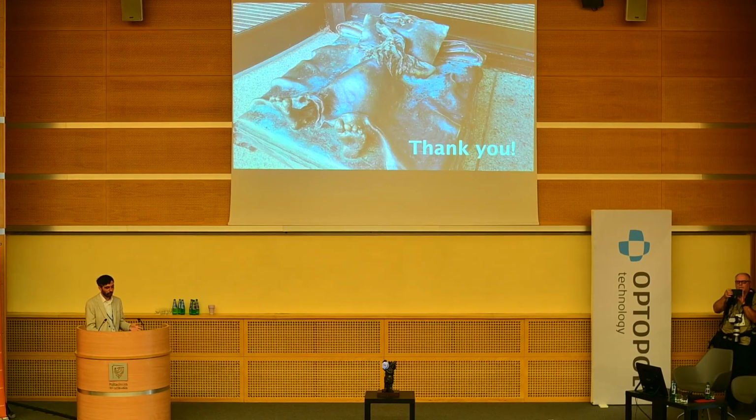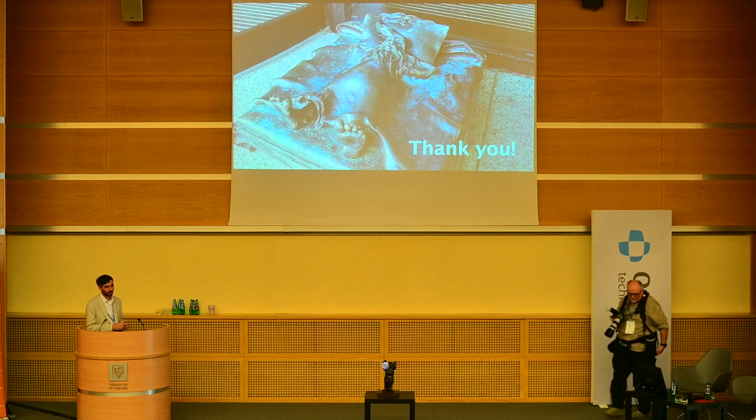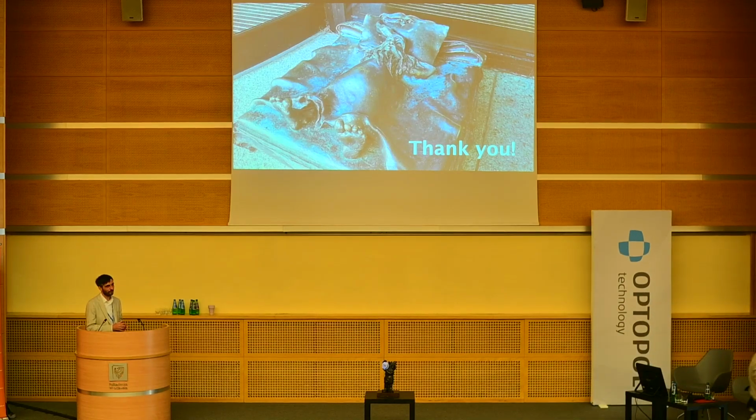This can be improved by choosing longer wavelengths for imaging, or by averaging several acquisitions, which is getting more and more done as devices are getting faster and faster. So I would assume that this will become better. But the question for choroid imaging is also how stable the thickness of the choroid is over time. That's something that's, I guess, under debate at the moment.